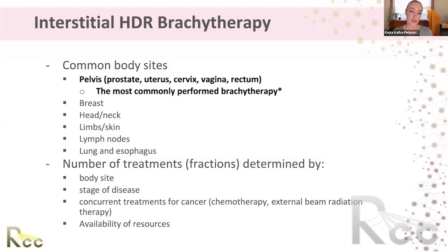There's breast interstitial brachytherapy at some centers. Also, some centers will do head and neck for recurrent head and neck cancers, base of tongue. Really, if you can get the needles in, you can treat just about anything. Lymph nodes is one of my favorite ones that we do with the guidance of interventional radiology.